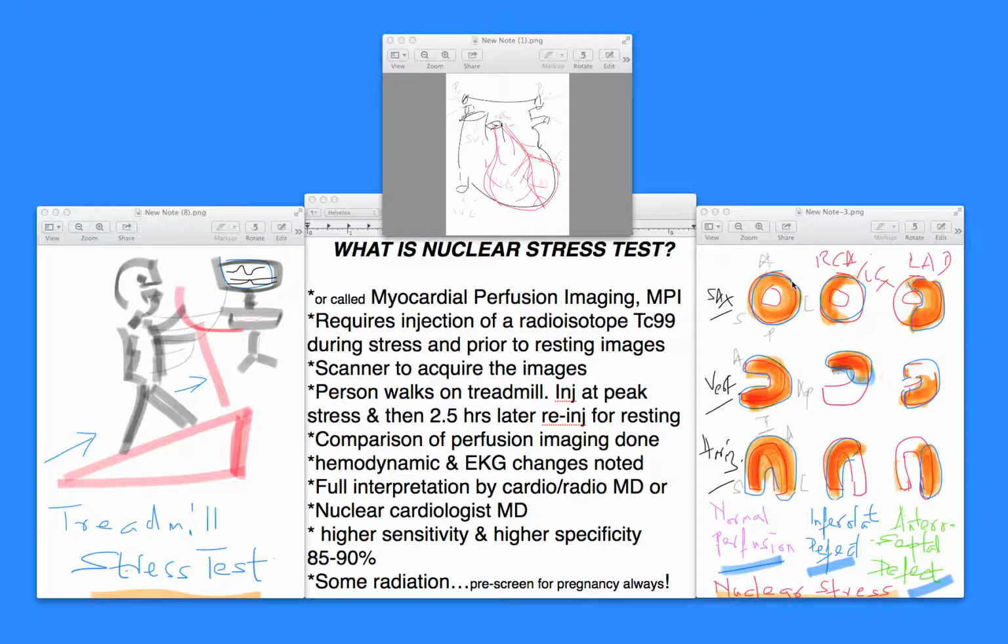So see, now even when the stress test, say, is normal, we'll have a normal perfusion looking like this. That means, look at this. The perfusion imaging will look like this, because the radioisotope, which is normally technetium-99, that's injected during the stress time, and if there is no perfusion defect, we call it a normal perfusion. That means the entire donut is complete, quote unquote. Here, look at this. The entire perfusion is intact. Here again, the perfusion is intact. That means the isotopes will be picked up by the scanner wherever the isotopes or the gamma particles are being recorded.